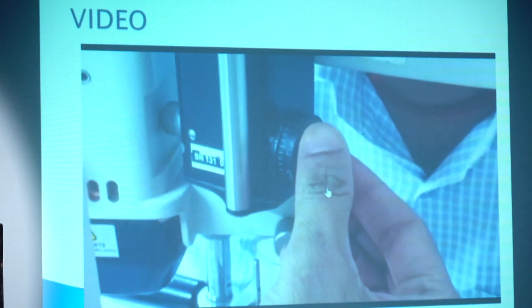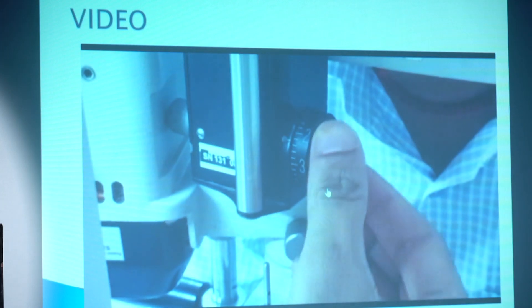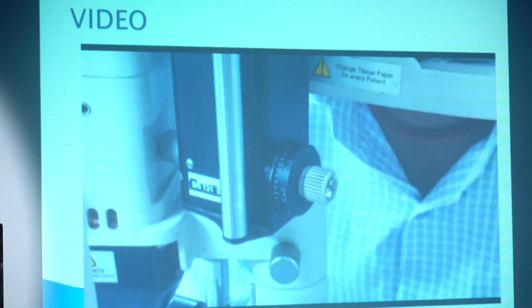Now just rotate the dial — in this case the pressure is nearly 23 mmHg. I got the endpoint here.